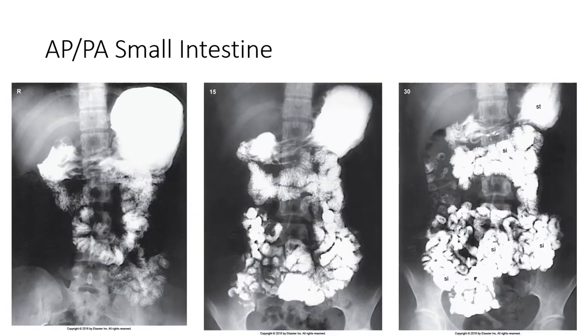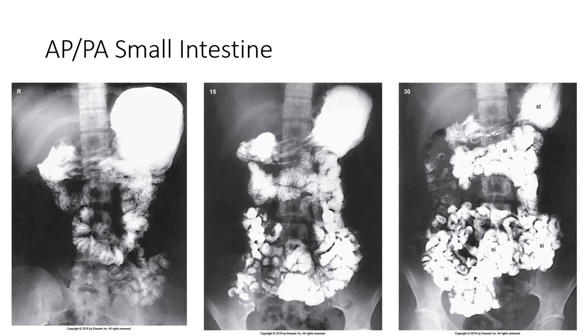Here you can see the difference in 15 minute increments how the barium slowly fills the small intestine. You can see on the 30 minute film at the right that the barium has already entered the large intestine as we see it beginning to fill the ascending colon. At this point, the radiologist should be consulted to determine if spot films should be performed to visualize the terminal ileum.